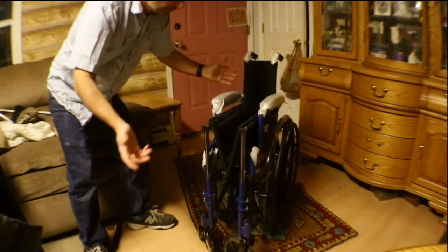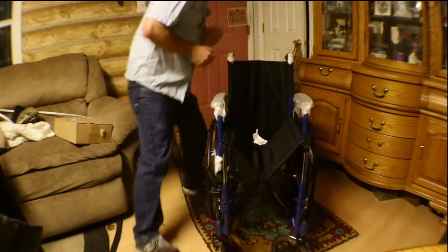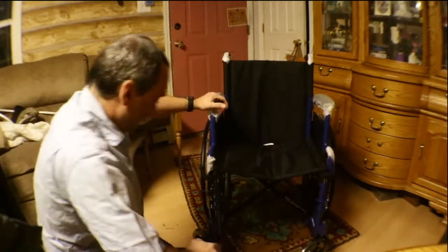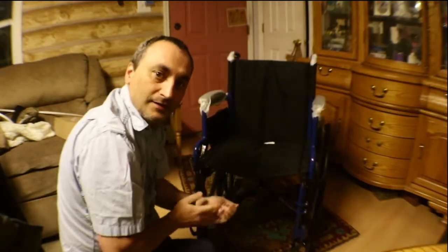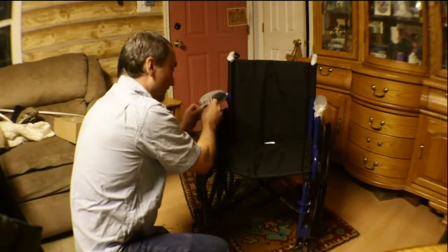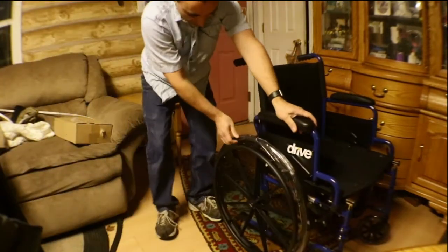Alright, standard looking wheelchair. Let me just pull it out here. So far nothing unusual — there's some protective plastic on it. I wouldn't say it's super heavy, but it feels sturdy. It feels pretty rugged, so that's good. I gotta get a knife to cut this stuff off.